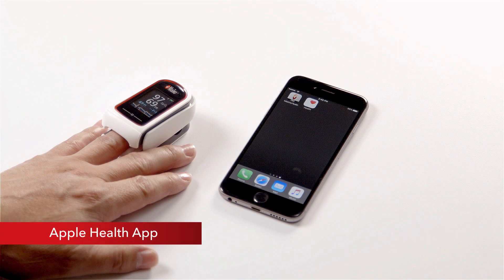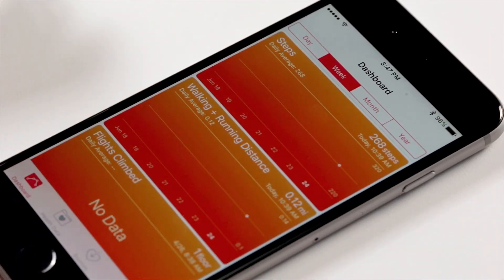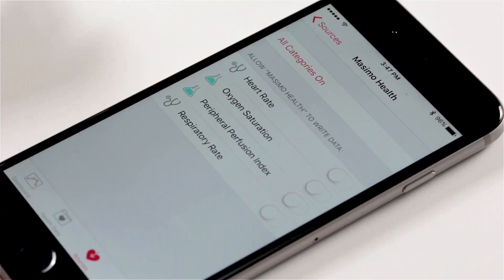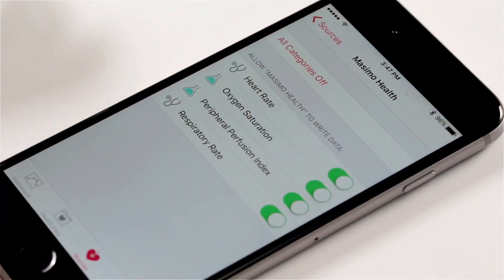Apple Health App: Additional features of the Massimo Professional Health App include the ability to share data with the Apple Health App. To share data, open the Apple Health App, tap on the sources icon, and enable the parameters to allow Massimo Health to write data. You may choose to share the following parameter data: Heart Rate, Pulse Rate, Oxygen Saturation, Perfusion Index, and Respiration Rate.